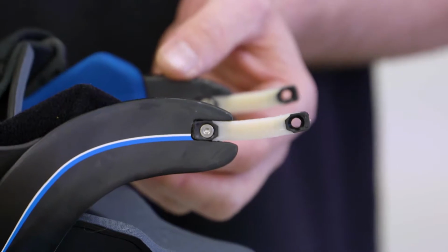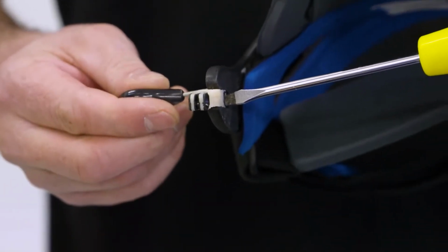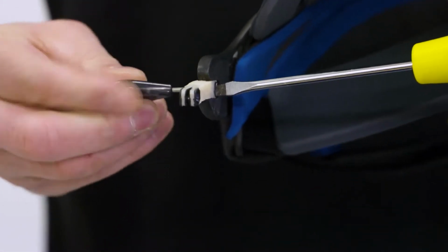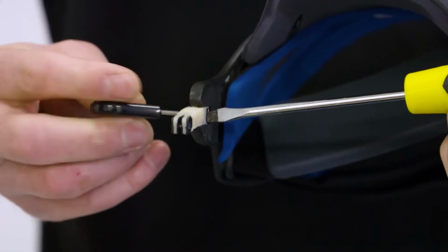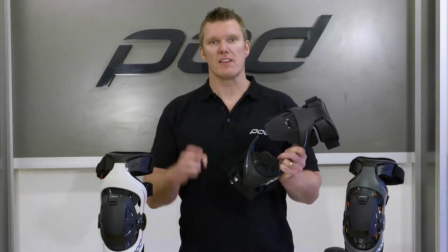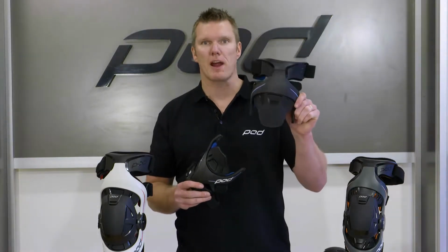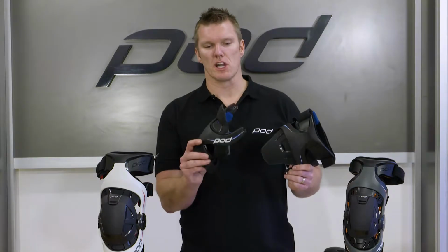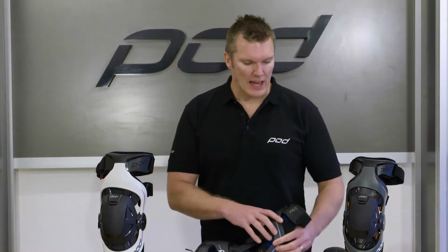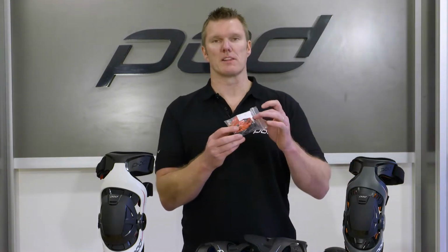So with the hinge housings removed, now you can use that flathead screwdriver along with the tool that came with your ligament rebuild kit. Undo the screws for the ligament so that you can detach the ligament from the upper frame. So now that we've taken the hinge housings, the ligaments off the brace, you can inspect your upper frame cups, pads, as well as your lower frame cups and pads. Make sure there's no damage. Today we'll be replacing a full knee hinge housing as well as the ligaments.